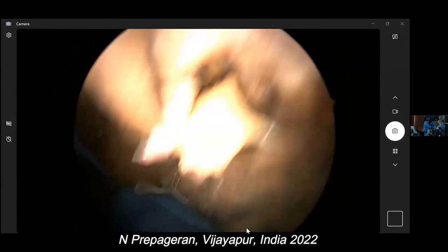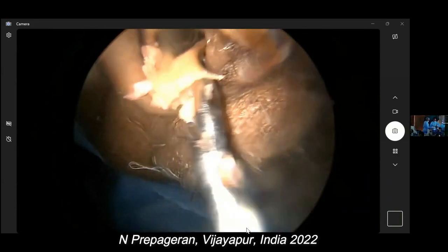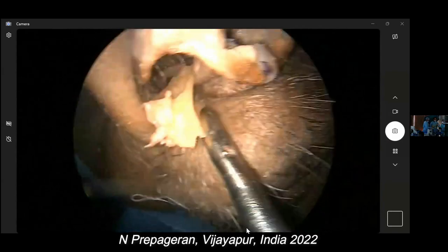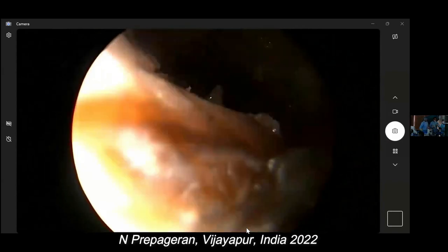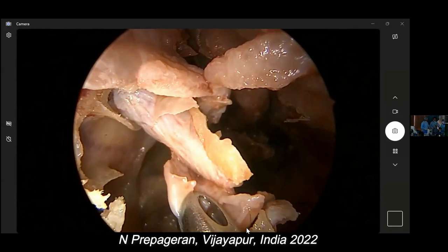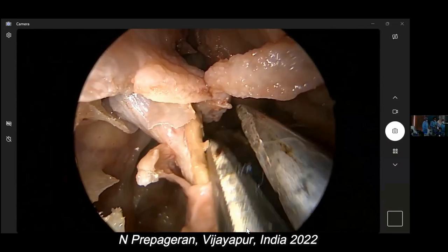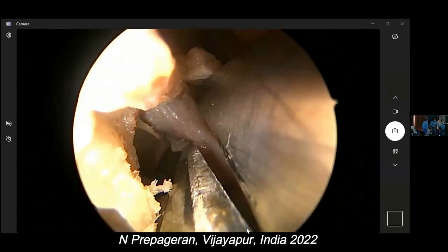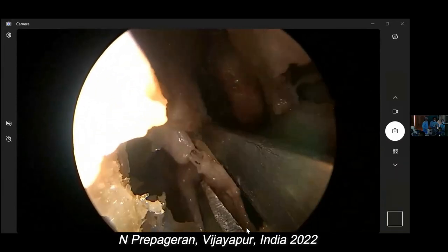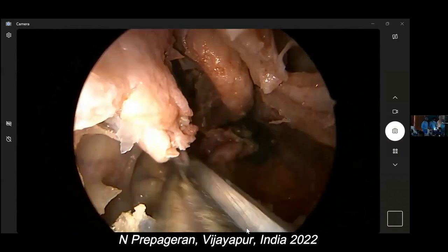Okay, good. There, can you see this? That's the anterior wall of the maxilla. Can you see the shape? Now, this is the pre-lacrimal approach. So, lacrimal duct, what you do is don't cut like this. Cut at an angle like this. So when you cut at an angle, you must marsupialize it straight away. And then give me a sickle knife.